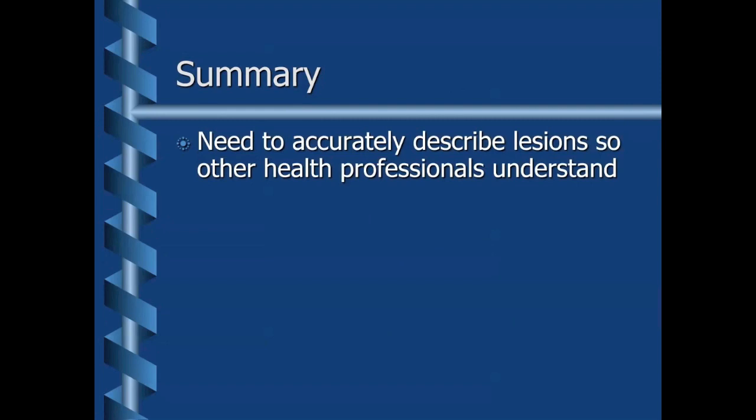Okay, so in summary, we need to accurately describe lesions so other health professionals understand what we're talking about and, importantly, can picture what we're talking about. That's an incredibly important day-to-day role of being a health professional, that you write really good patient notes, and other health professionals can understand what you're describing or what you're seeing, in this case on the x-rays.